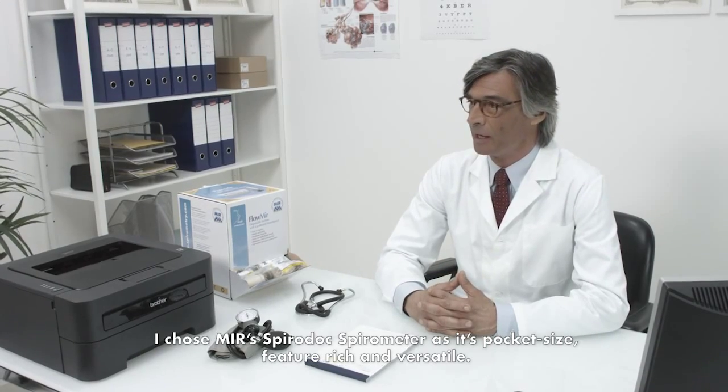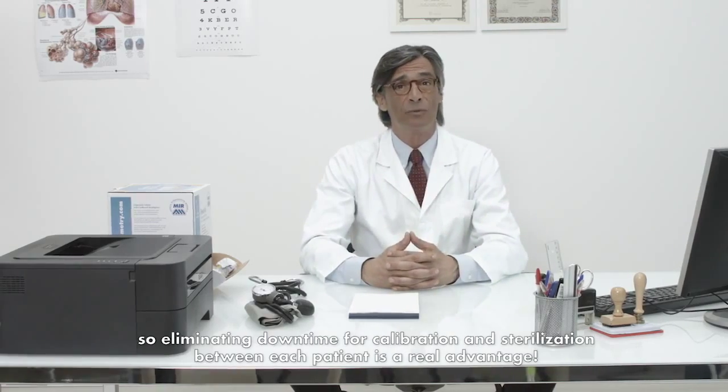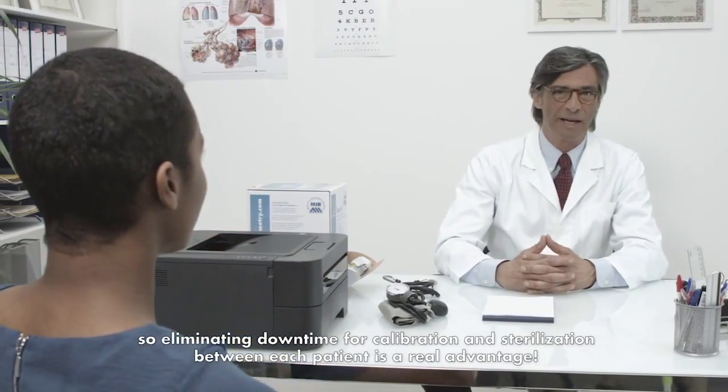I chose the MIR SpiroDoc Spirometer as it is pocket-size, feature-rich, and versatile. My office is always crowded, so eliminating downtime for calibration and sterilization between each patient is a real advantage.